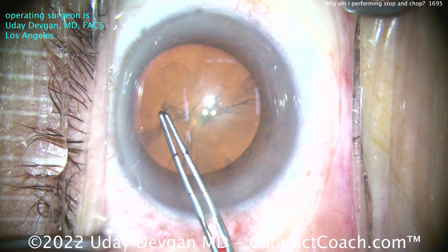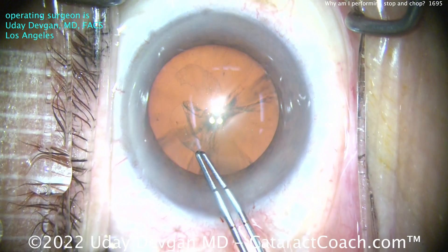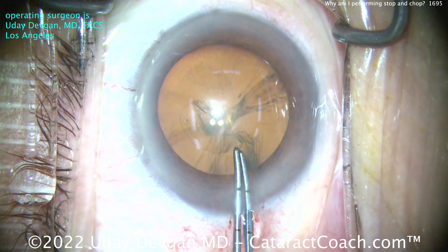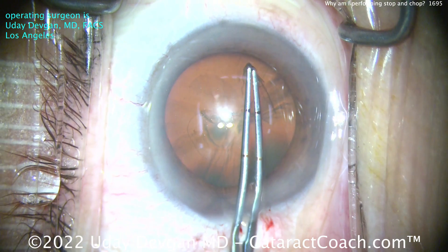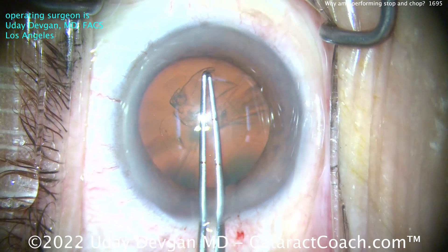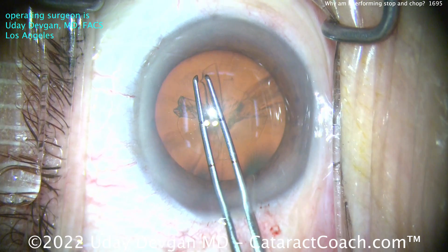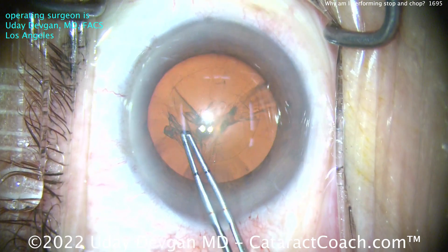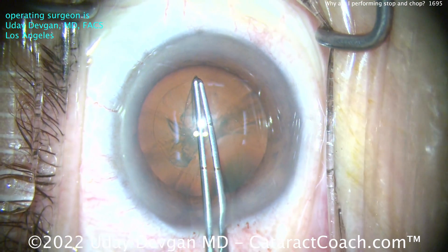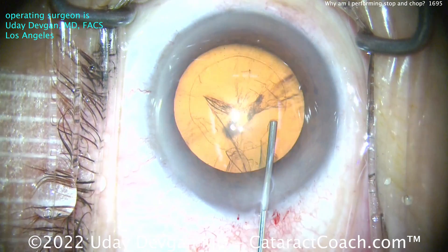The reason I want to do a stop and chop on a case like this is there's one advantage. Remember, if I chop a nucleus in half with FACO chop, what's the size of each piece? 50% and 50%, right? You split the nucleus in half. But if I use a stop and chop technique and I dig out a central trench — I sculpt a central trench in the nucleus, about two FACO tips in width — and then split the nucleus in half, what's the volume of each half? Maybe 40% and 40%, or 45% and 45%.